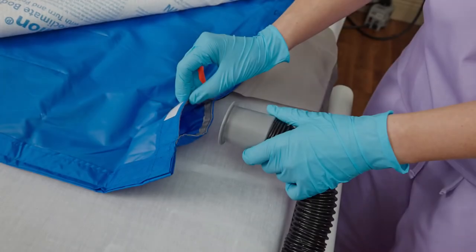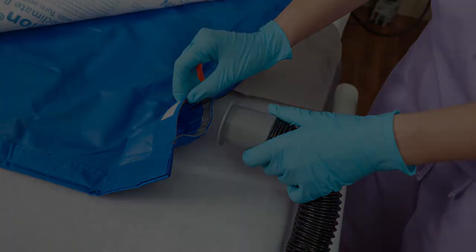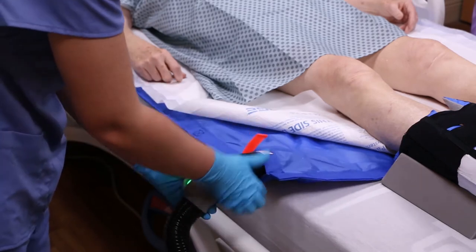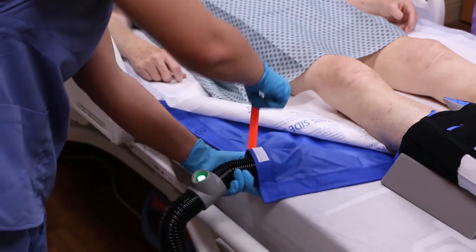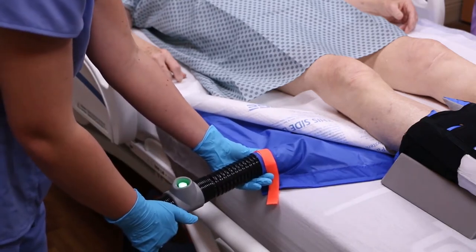To inflate the glide sheet for patient positioning, locate the bilateral valve closest to the booster pump. Pull up on the Velcro tab, separate the fabric opening of the valve, grasp the hose and glide sheet, and pull the Velcro tab to cinch it around the hose.